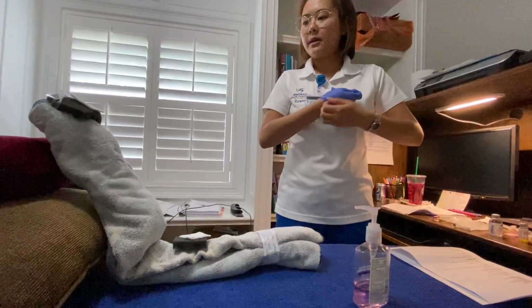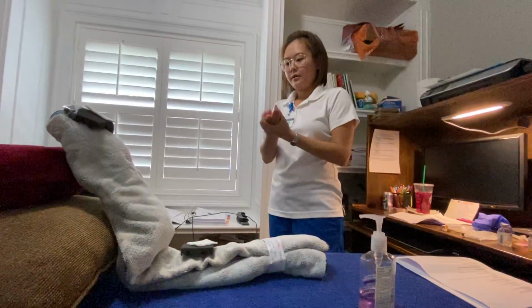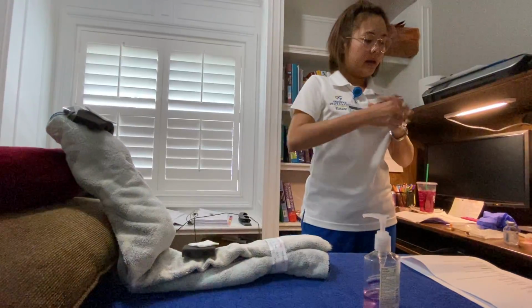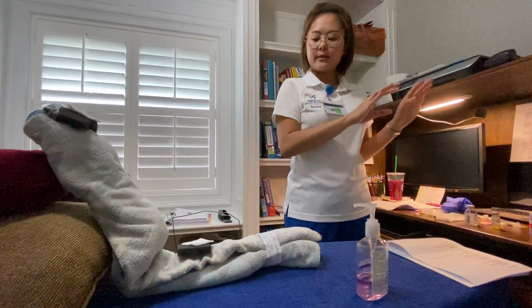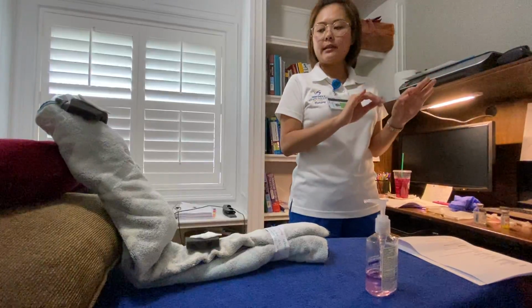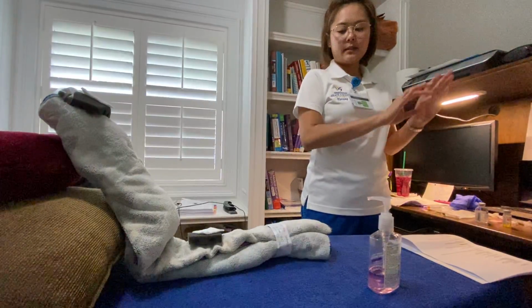Are you still doing okay, ma'am? Yes, okay. Take off my gloves, biohazard, wash my hands. Okay. And then document my assessment: the sub-Q injection was given in the abdomen, and the flu shot given on the right deltoid, and the documentation has been done.